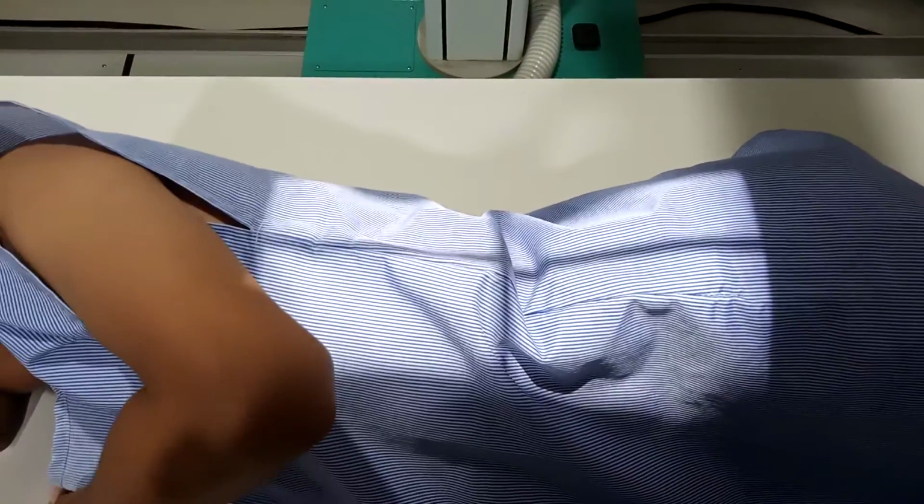Then the evaluation criteria: the intervertebral foramina, starting from the L1 to L4 vertebral bodies, intervertebral joints, the spinous processes, and the L5 to S1 junction must be clearly demonstrated. Then, in position, the spinal column must be aligned parallel to the IR as indicated by open intervertebral foramina and open intervertebral joint spaces. No rotation is indicated by superimposed greater sciatic notches and posterior vertebral bodies.